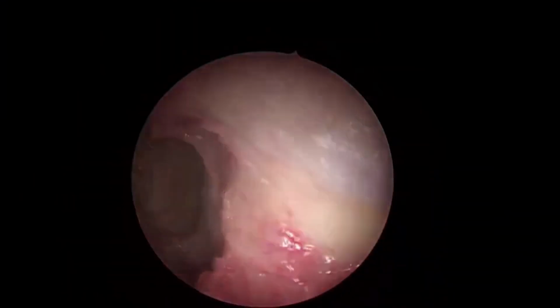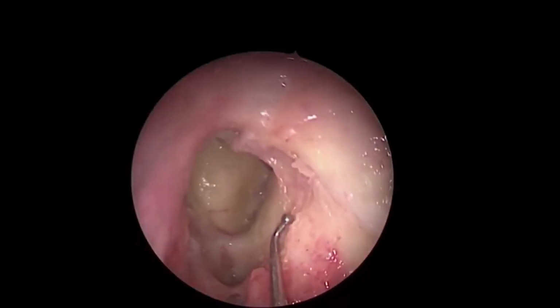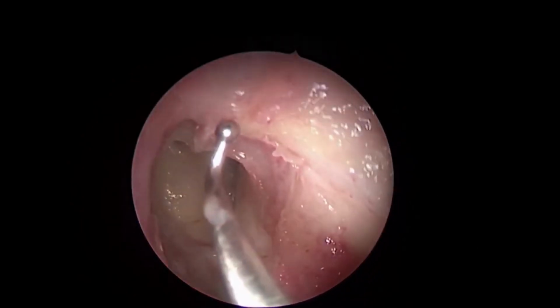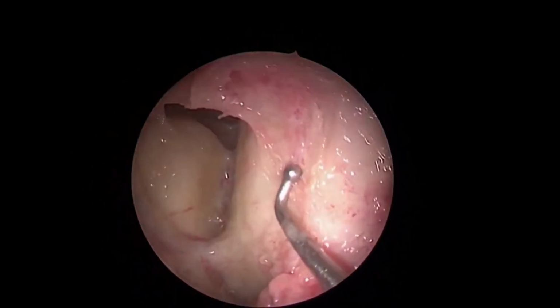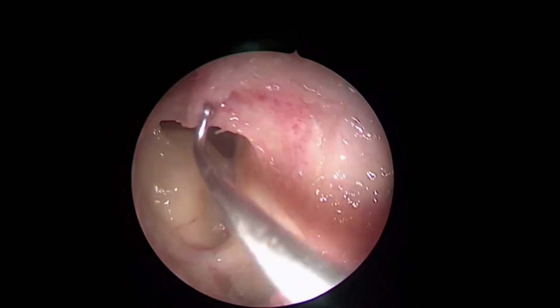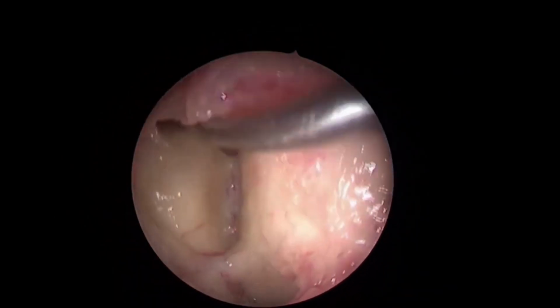I am trying to show what you have mentioned. This is my lateral wall, this is my medial limit, and this is my beak. Just follow the beak, staying between the lateral and the medial limits. Wherever the beak ends, it has to be frontal.